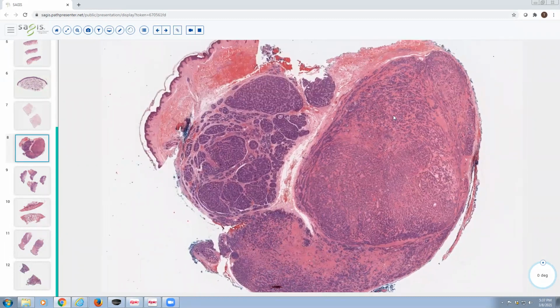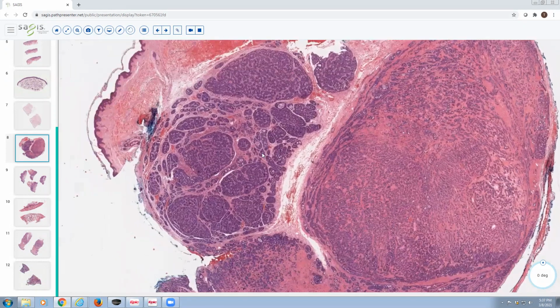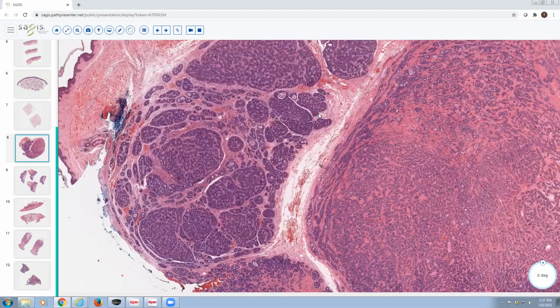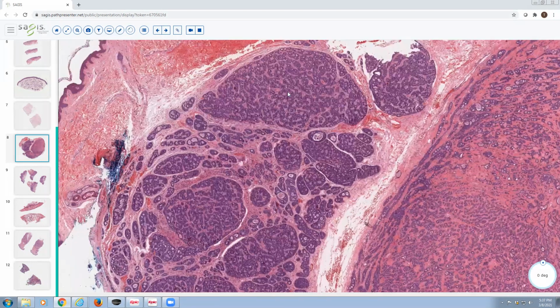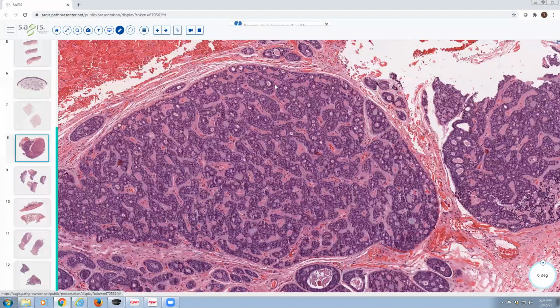You've got a very large tumor, asymmetric, it looks like it's kind of bottom heavy here. Adenoid cystic carcinoma is basaloid or basophilic, so the tumor is going to appear kind of purple on scanning. And it has an architecture that's described as cribriform. And cribriform simply means perforated by small holes. So you've got a tumor which has tons of little holes punched into it.